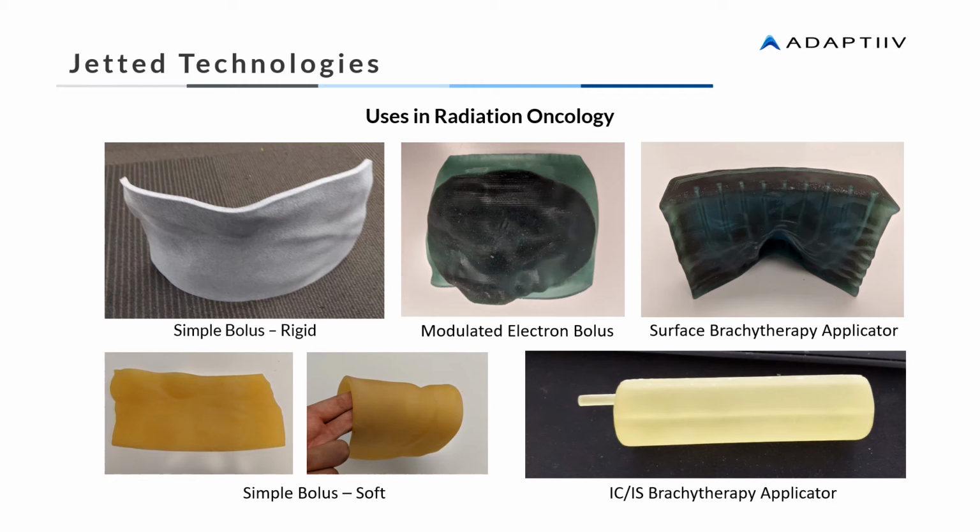Also of note is that the printers are capable of producing highly accurate surface brachytherapy applicators, but similar to SLA technology, those applicators must be printed in 100% infill only. And another advantage of jetted technologies, similar to SLA, is the presence of biocompatible materials, enabling the application of IC and IS brachytherapy solutions.